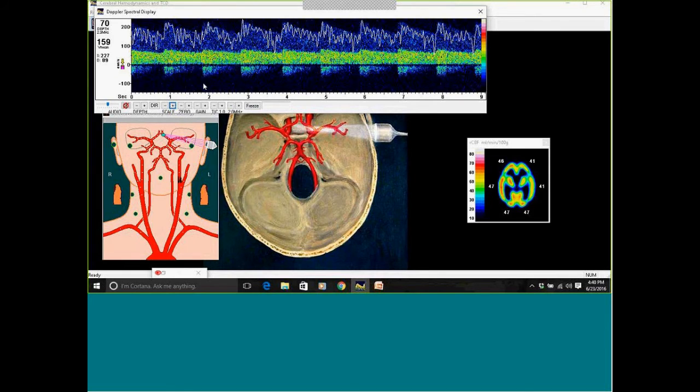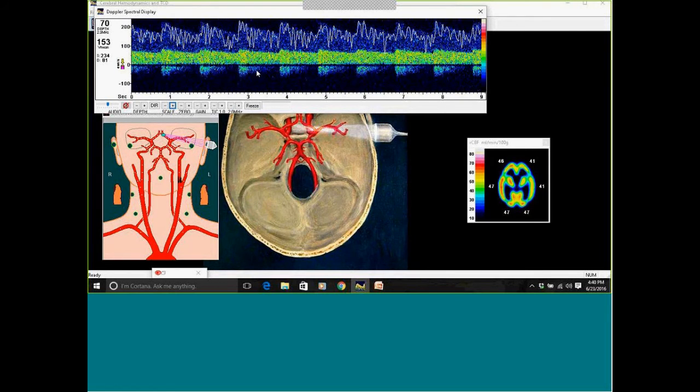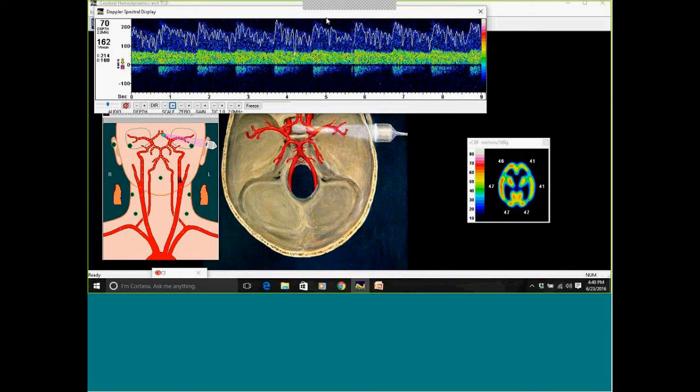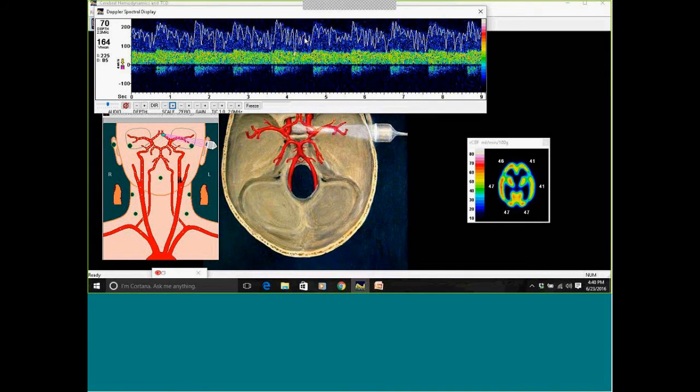This is not your anterior cerebral. If you were to have the measurement on that, you're going to get flows here in the 20s. This is not the ACA. This is a branch that's dilated up. So this is your middle, and this is your anterior coming towards the probe. Remember, you only see this, folks, when you have got a carotid occlusion or near occlusion.